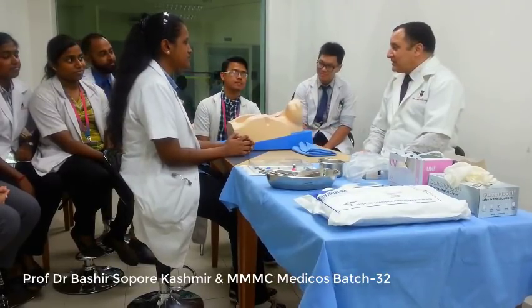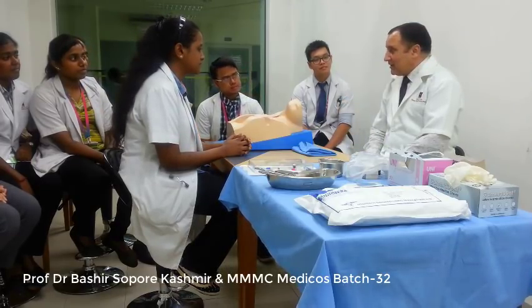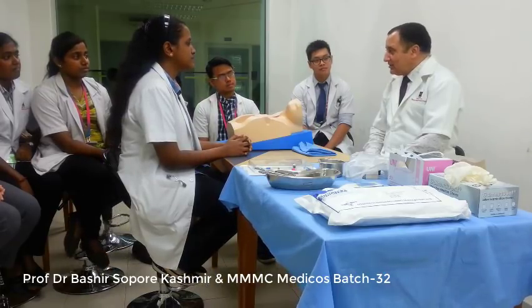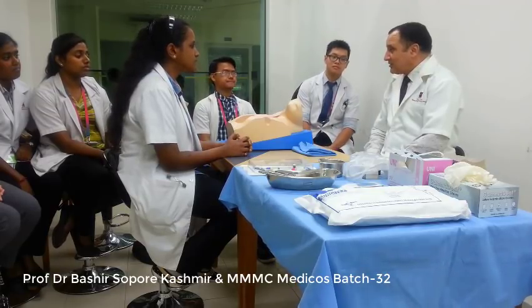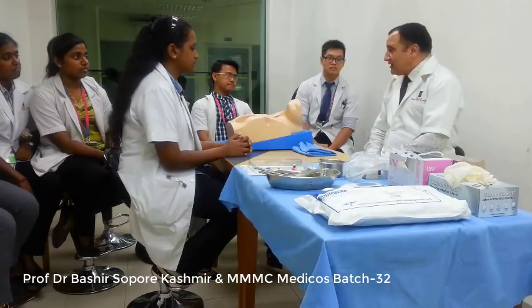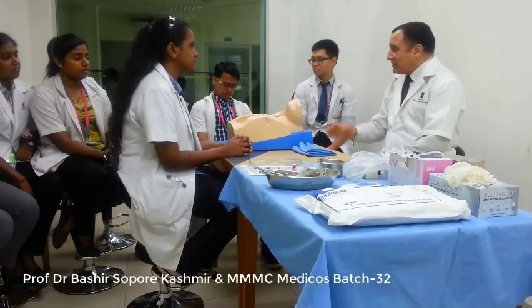Because we know that whenever the patient has got the peripheral veins collapsed, and there is no easy access to these veins, then you want to keep the patient in Trendelenburg position so that the internal jugular vein gets congested and dilated.